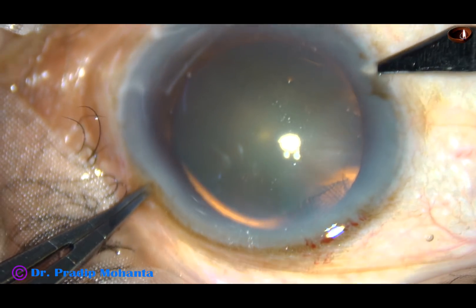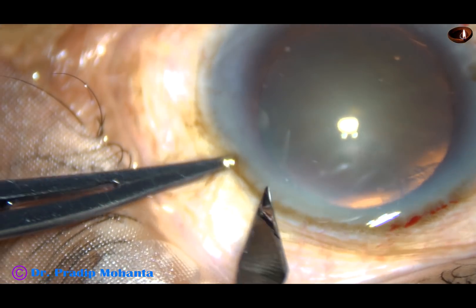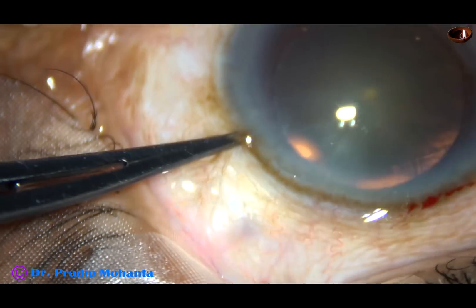By this time, the main incision has been made, viscoelastic substance has been injected and two side ports also have been made.